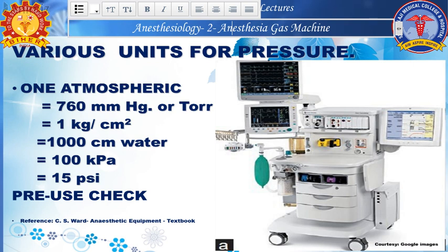So all these 5 units, please remember them, so that when somebody is used to only one unit, you can get an idea, convert it easily, and come to the exact pressure they are conveying. Otherwise, like money, you will be losing so much. Similarly, you will have an inaccurate understanding about the pressures used in the system. This is very important. You can't just neglect it.